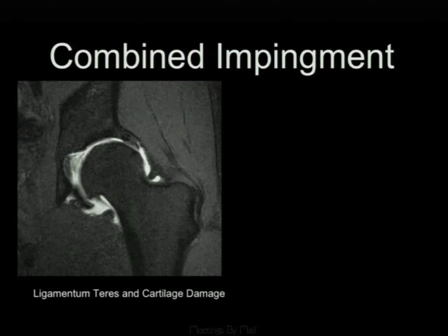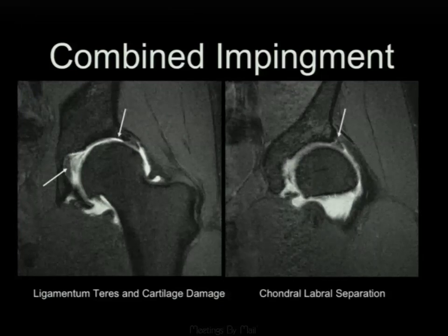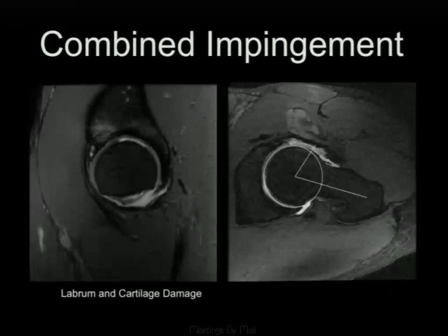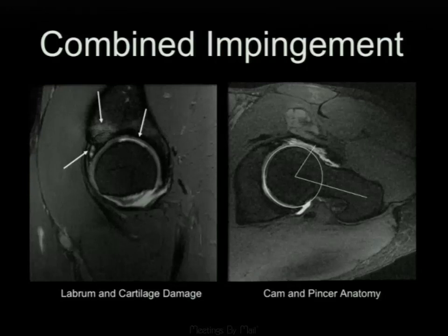In combined impingement, many findings occur together. We see damage to the ligamentum teres, loss of articular cartilage overlying the acetabulum, which is subtle but important prognostically. The surgeon needs to know whether microfracture will be performed at surgery, or whether the patient has progressed too far for FAI cheilectomy to be helpful. On the oblique axial view, we measure the alpha angle, which is clearly abnormal, and on the oblique sagittal view, labral damage anteriorly and marrow edema in the acetabulum due to cartilage damage.